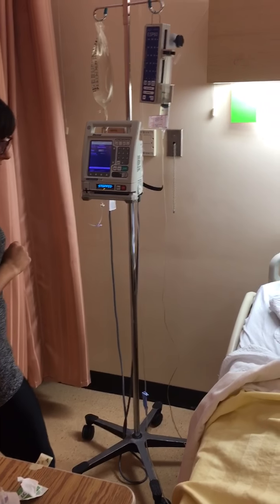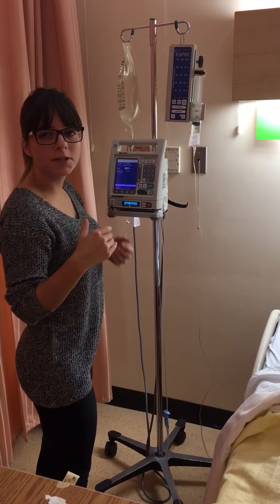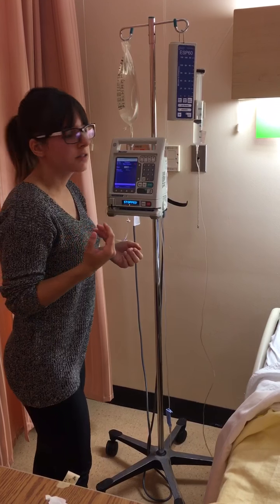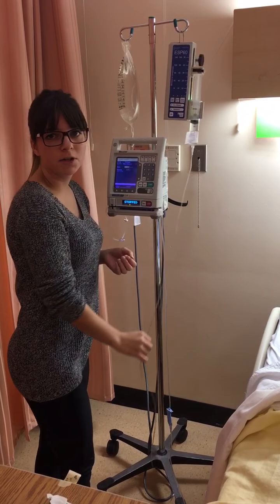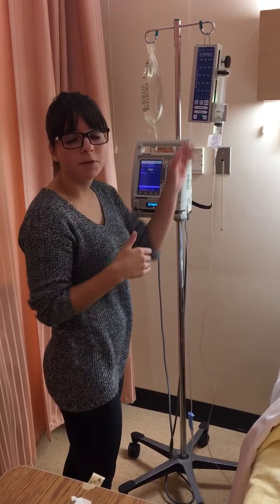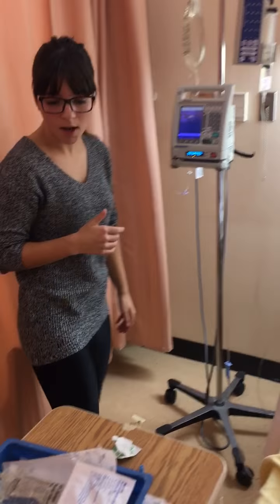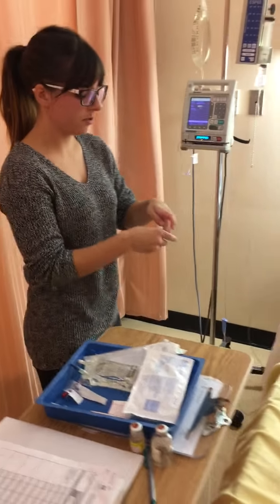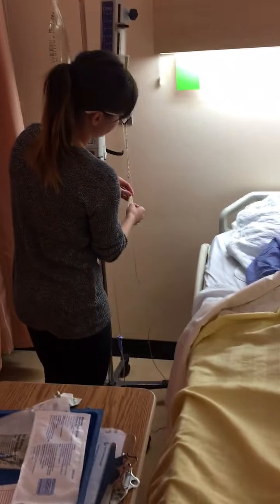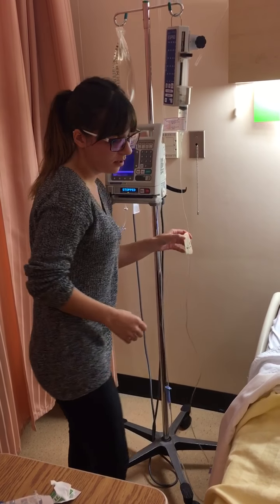So that has begun. After this is finished, I'm going to be administering 3 milliliters of normal saline. That's going to make sure that all the medication is out of the tubing, and I'm going to be infusing that at the same rate as I just infused this medication. Okay. I'm going to make sure that I label the tubing. So we've got our date, time, and initials on the tubing there.